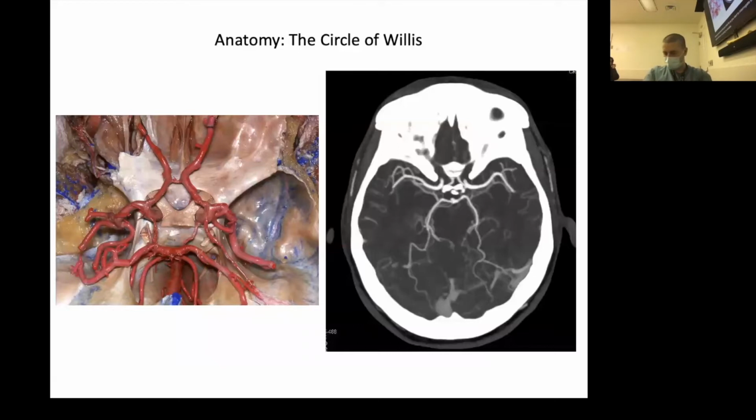And then, of course, the vessels themselves, this famous anatomical structure, the circle of Willis, which is a confluence of the great cerebral arteries of the head. And most importantly, for the non-neurosonologist, you really want to interrogate MCA territory waveforms, because for the most part in the ICU, we are looking for global phenomena like vasospasm, ICP, etc.